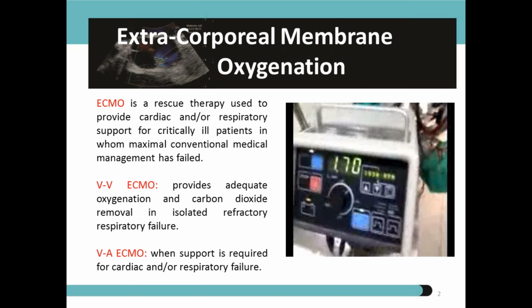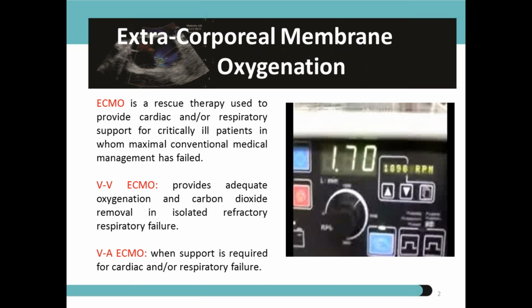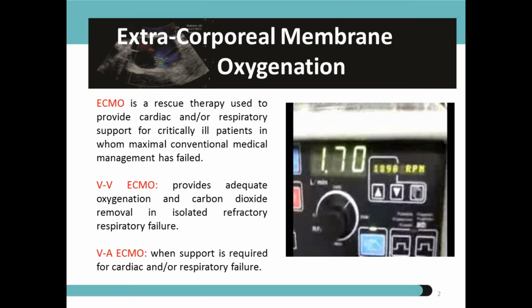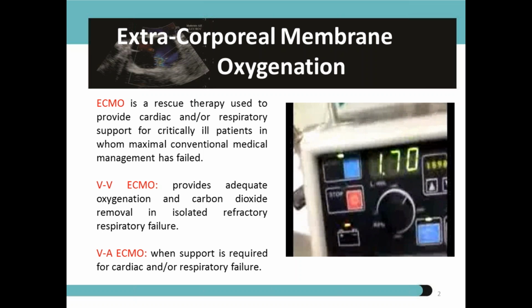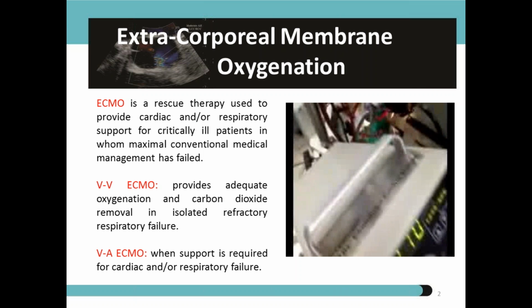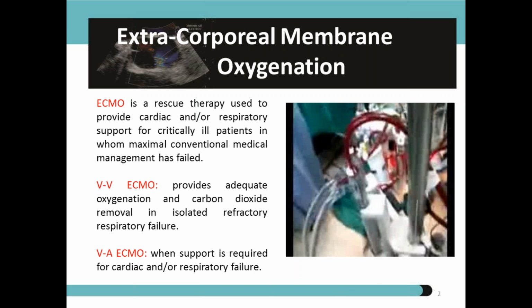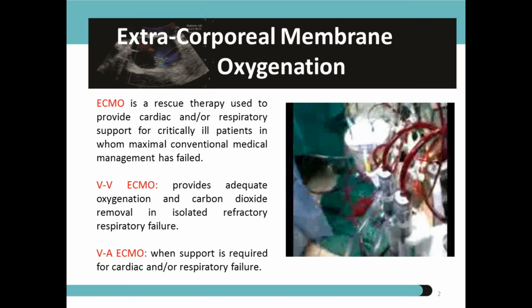Now, developing on that concept, in 2007 up to 2010, the cardiac surgeons and the anesthetists and the perfusionists of AIIMS did the concept of integrated ECMO, wherein if we decide that our patient has arterial switch operation with an intact septum or a VSD, and there's a typical D-TGA with a regressed LV, and the patient is more than 3 weeks old, then we put the cannulas in the patient as we would do for an ECMO while on bypass.